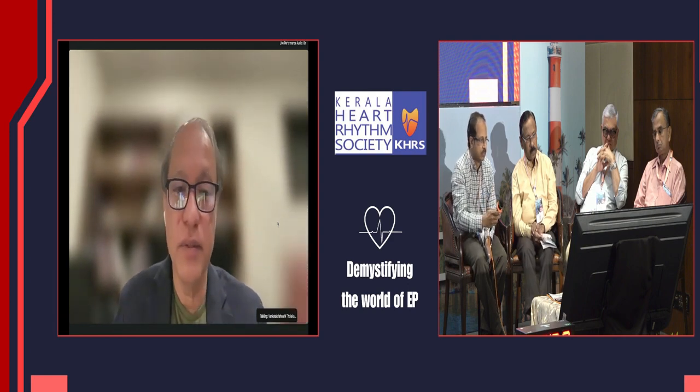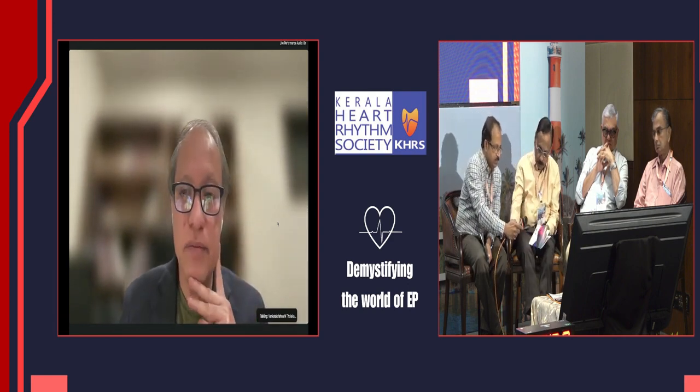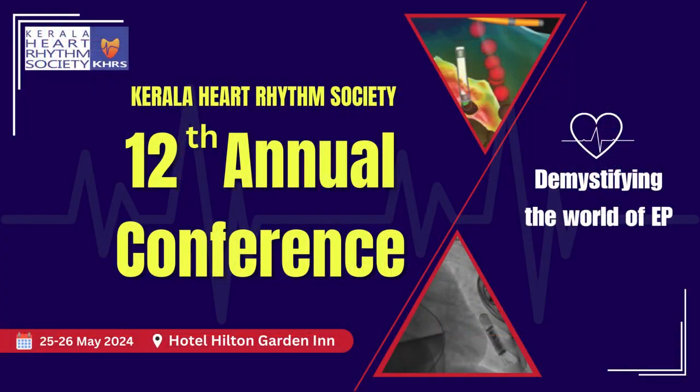Thank you very much for a great question. In fact, one of the things which is being under study, I think as I briefly alluded to the Hiroshi Nakagawa's histological work, one of the things we are slowly understanding is because the pulse field, when it is delivered, one of the problems you see is you lose the electrograms immediately, and acutely it looks like you cannot really know whether the ablation is done as a reversible component. Could there be a reversible component still present? This is obviously a debate. There is no parameters at this point of time to know the tissue feedback.